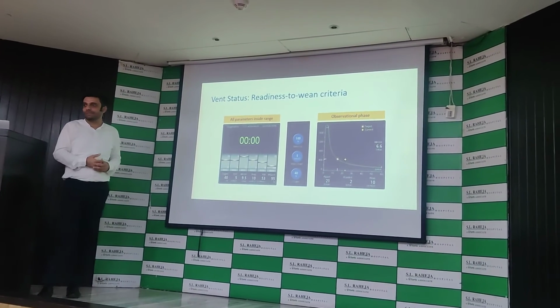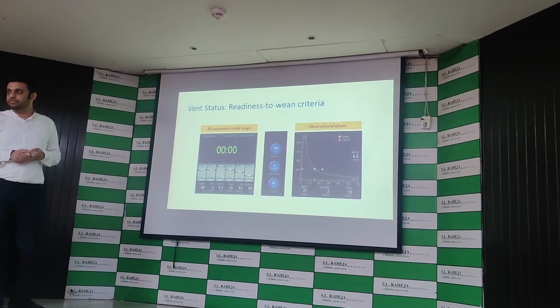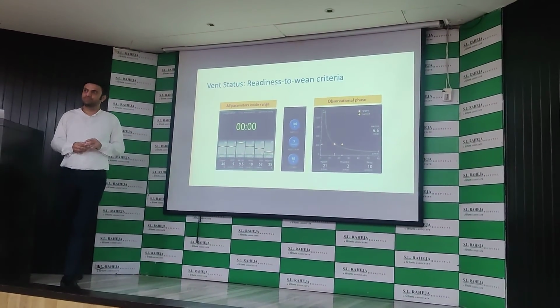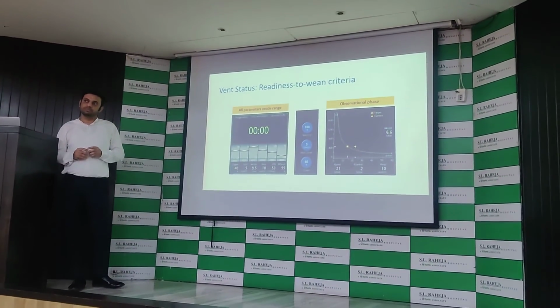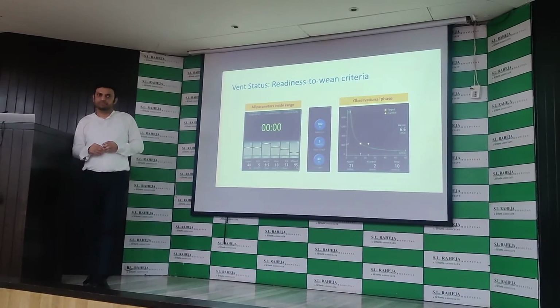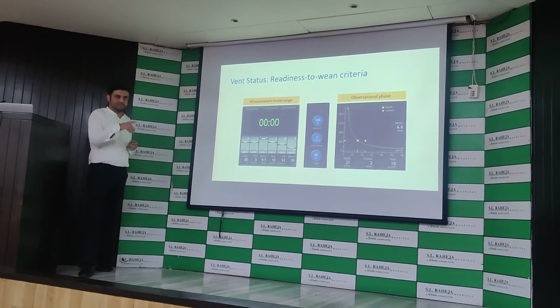You were asking something? Yesterday when we had a patient, it was going on for like 2 hours, no? The SBT timer just kept on going. It will not show extubate; it will just keep on displaying 2 hours, 3 hours, 4 hours, unless you go on to an SBT.